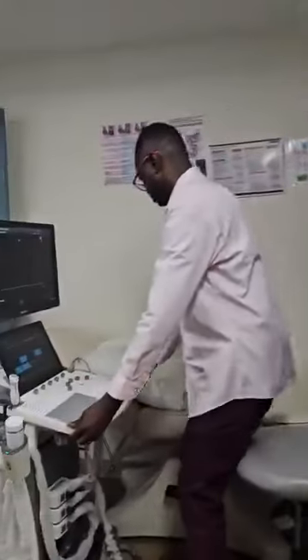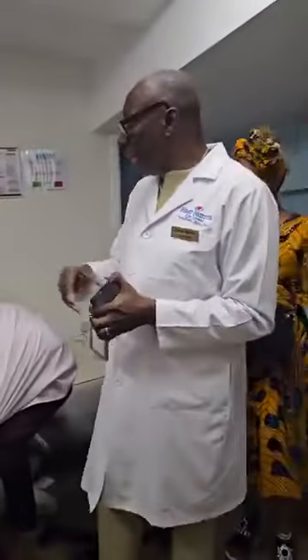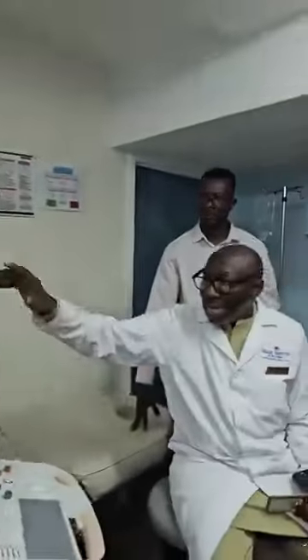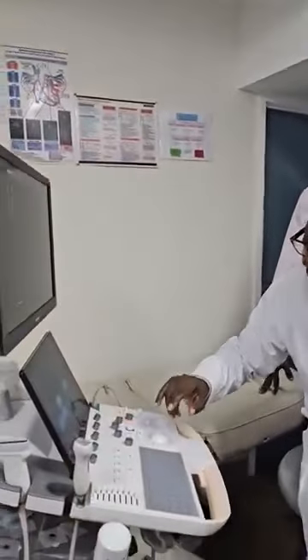This is one of our echo labs where we do ultrasound, cardiac imaging, echocardiogram. The probe I showed you, we can use it with this machine, so we can connect it. You see here, if I remove one of these, I can put the console of that one there, and then drop it down, and then get the pictures in here. Let me see if I can open.